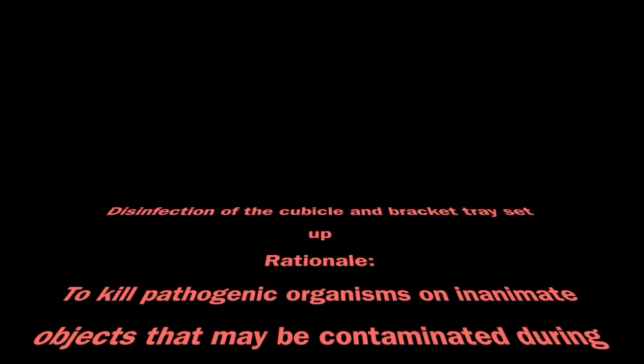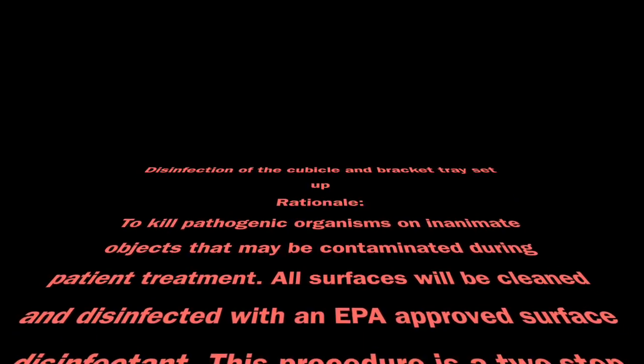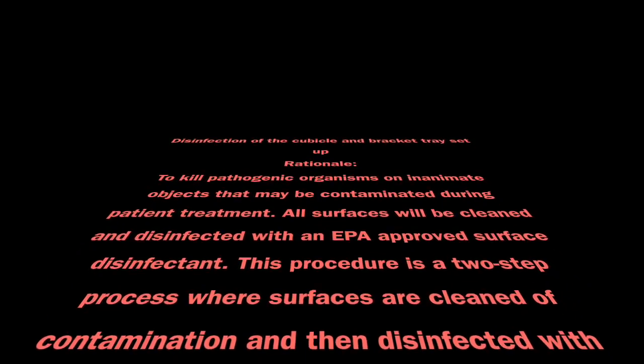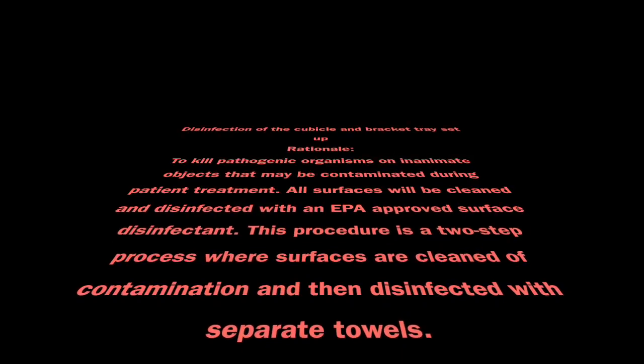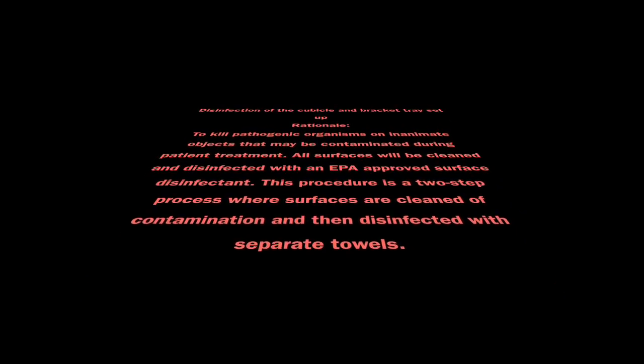The cubicle and bracket tray setup. Rationale: to kill pathogenic organisms on an inanimate object that may be contaminated during patient treatment. All surfaces will be cleaned and disinfected with an EPA-approved surface disinfectant. This procedure is a two-step process where surfaces are cleaned of contamination and then disinfected with separate towels.